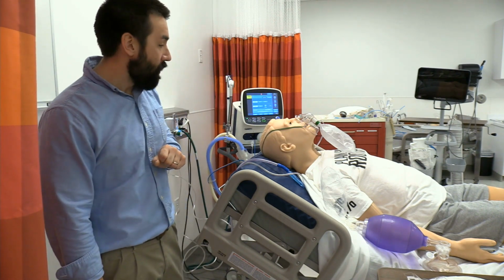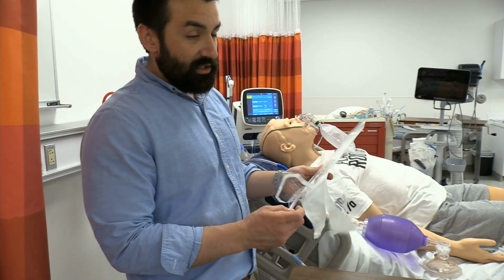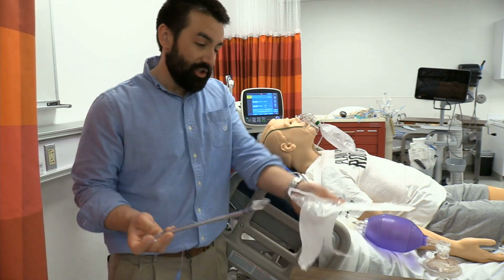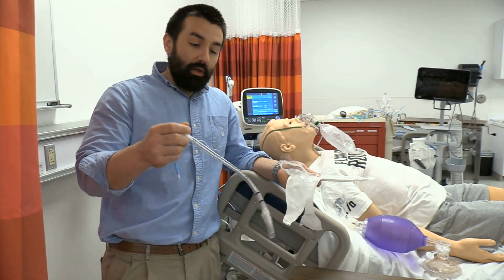They tend to fall over. So some of the other supplies I have set up here. The physician knows we're intubating, but she hasn't had a chance to come through yet. So I just grabbed a size tube that I think is appropriate for this average size adult male. I have an 8.0 endotracheal tube.